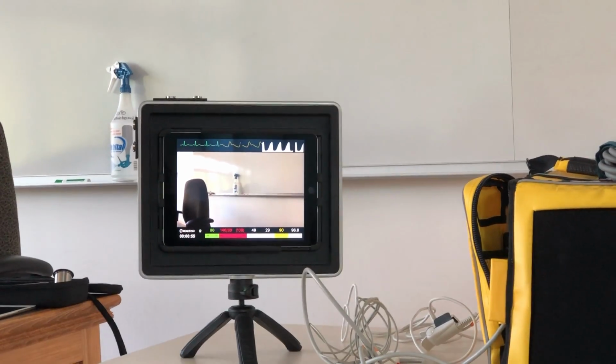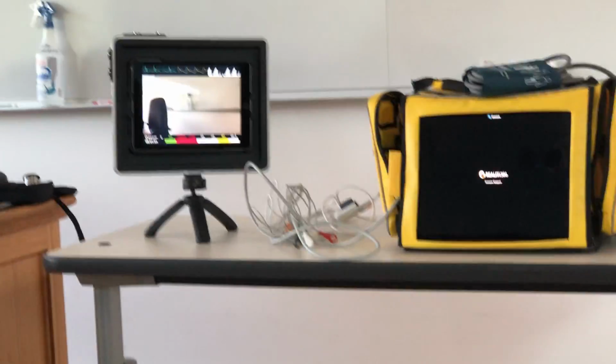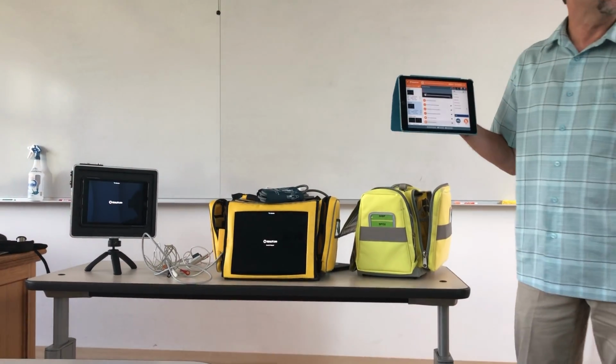It's showing me the waveforms that were going on at that time. It's showing me the vital signs that were happening at that time, and whatever was going on in the video screen. And you can hear the audio coming from it. Right now, we don't have anything set up on that to play it back.